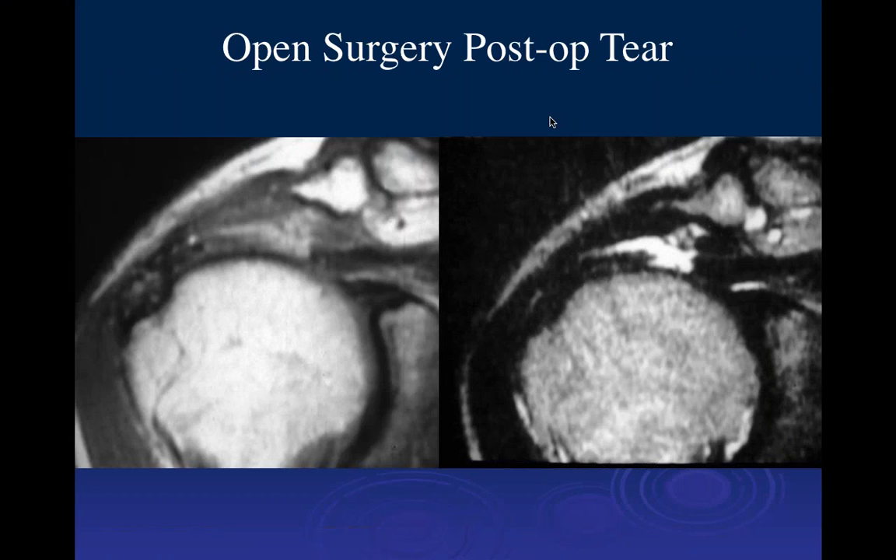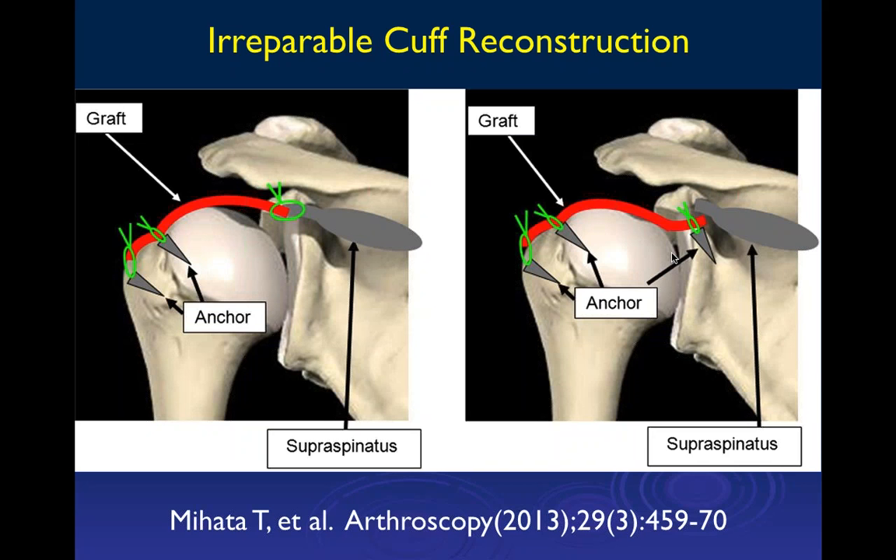We can see the patient had prior open surgery from a number of years ago, and we can see a recurrent tear. There is clearly proximal retraction at the musculotendinous junction, a full-thickness tear with retraction of the supraspinatus tendon, and fluid going through the tear. This is clearly a post-operative tear.